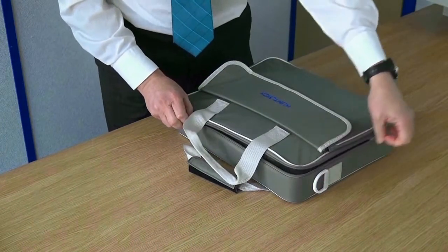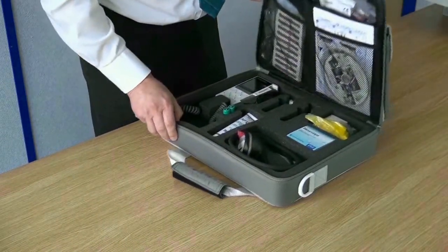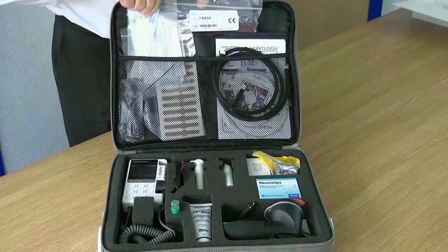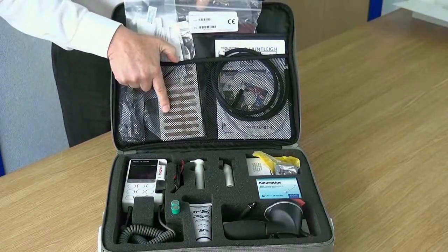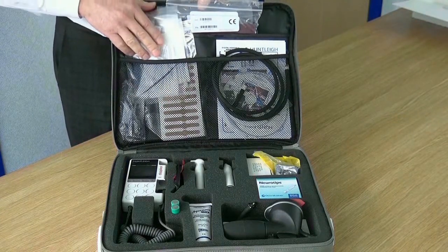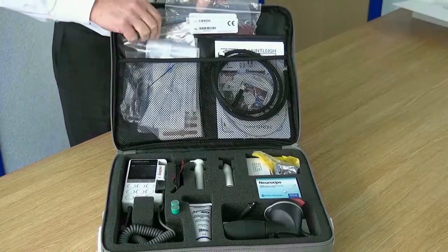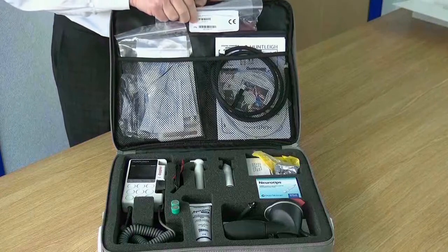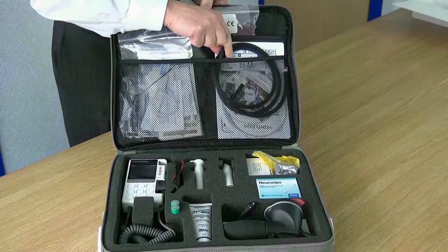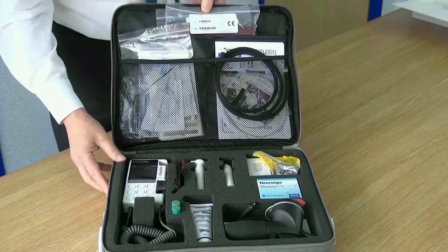The ankle and toe pressure or ATP kit includes: DMX rechargeable digital Doppler, medical grade recharging kit, EZ-8XS wide beam 8 MHz Doppler probe, APPG probe and adapter, latex free toe cuffs and inflator, latex free arm and ankle cuffs, trigger operated spig, neuro pen and box of tips which includes a 10 gram monofilament, educational CD, and large carry bag.